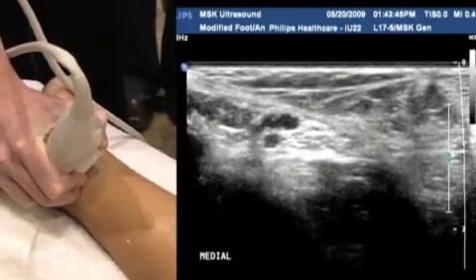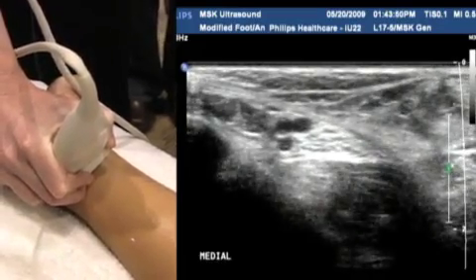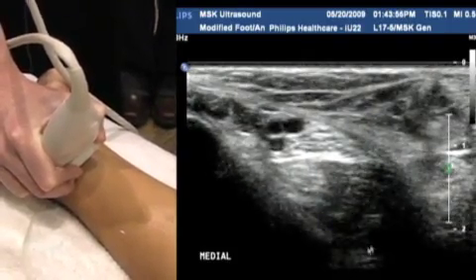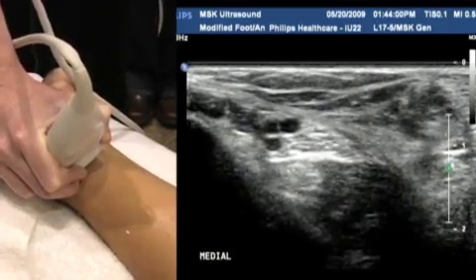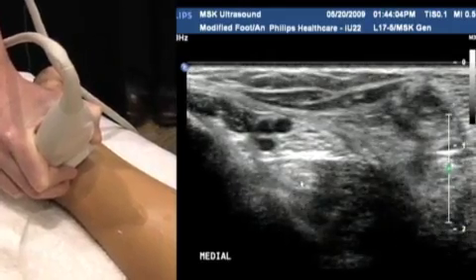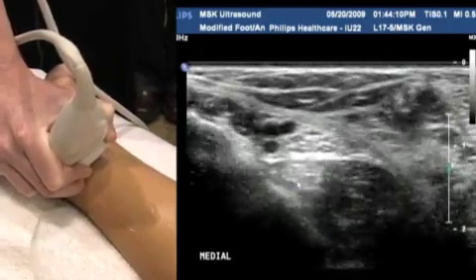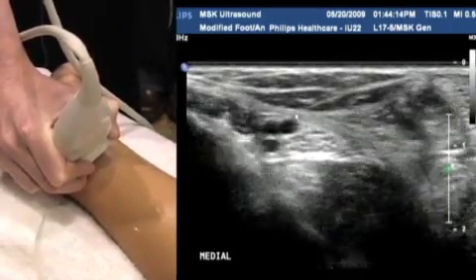because of its depth, is a little more difficult to define at times, but again, it's important to be aware of the echogenic tendon here and its more hypoechoic muscle around it, which can be a good landmark. It's obviously a lot larger than the tendon itself, so sometimes it's easy to isolate the muscle and then really focus your eye a little bit more superficially to the tendon here. And this sits back in its calcaneal groove back here, below the tarsal tunnel.